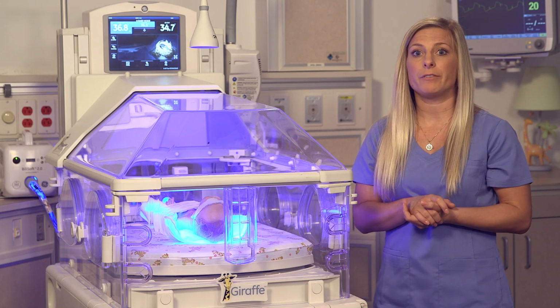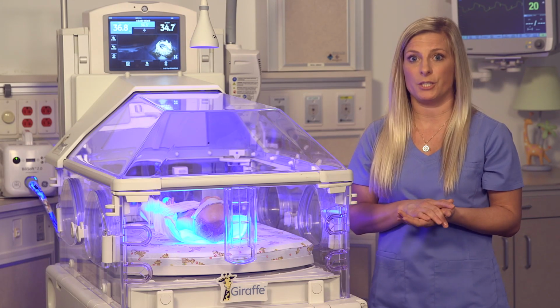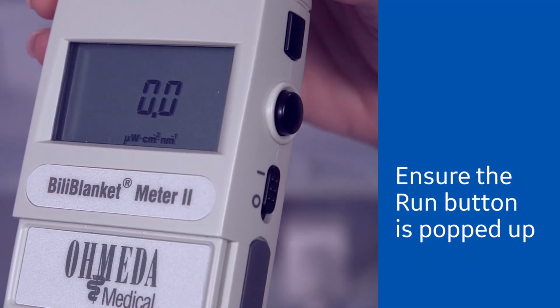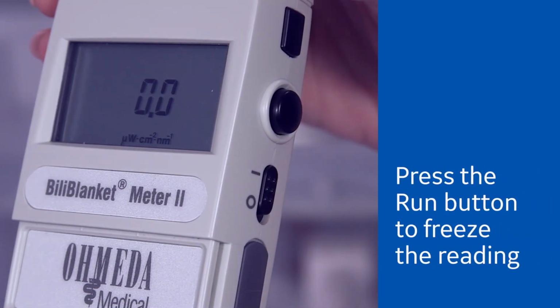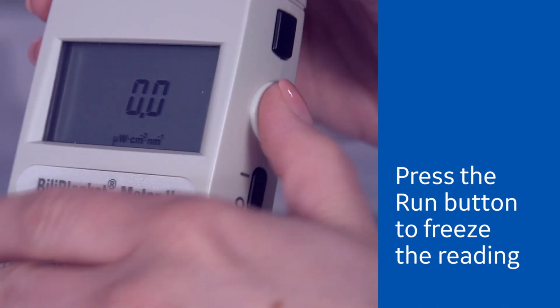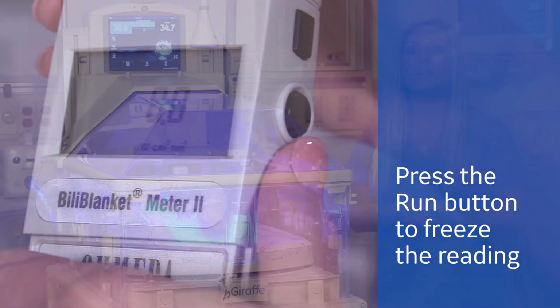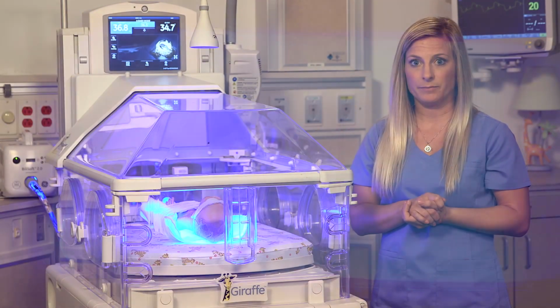To quickly measure the irradiance of the BiliSoft, set the Hold Run switch to the Run position. It's this round button here. The BiliBlanket Meter 2 now performs continuous irradiance measurements. To freeze the display and irradiance reading, press the Hold Run switch push button to set it to its inward hold position. This freezes the display reading at the current spectral irradiance level.